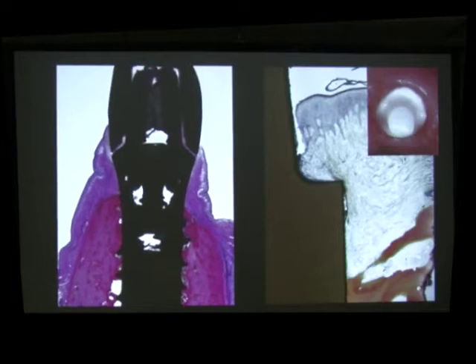So most of the implants that we do immediately come out like this, so we can see not just the abutment, but the actual shoulder of the implant. And the crown should not start deeper than the first millimeter of the sulcus. So this is the shoulder of the implant, and this implant will always be healthy because the distance from the margin to the bone is very important. If we put the margin deeper, then we will have swollen and not healthy looking gums.